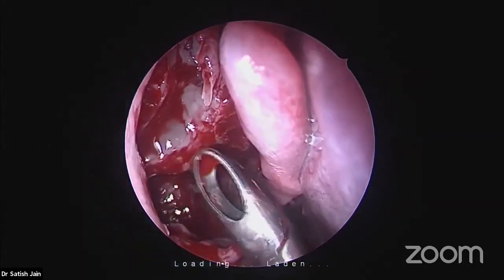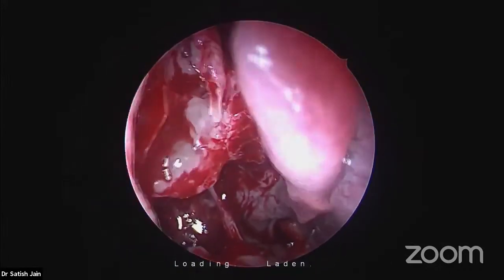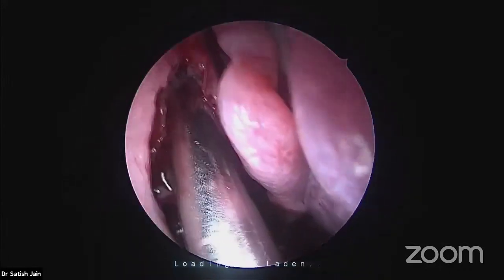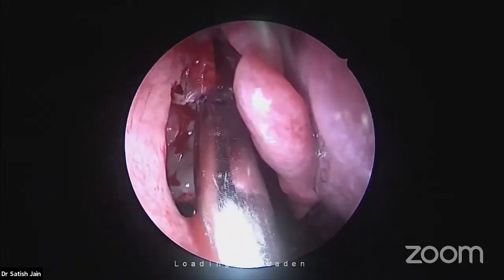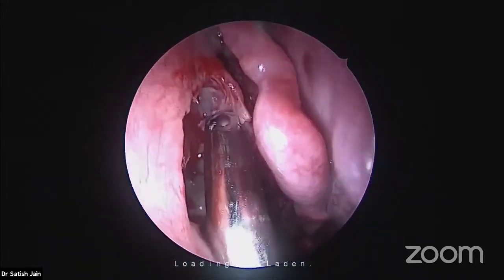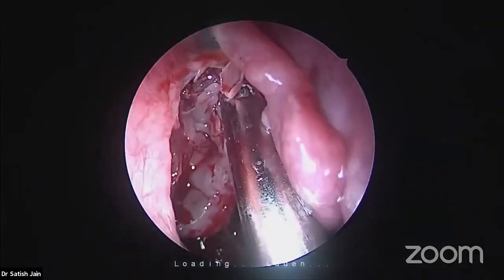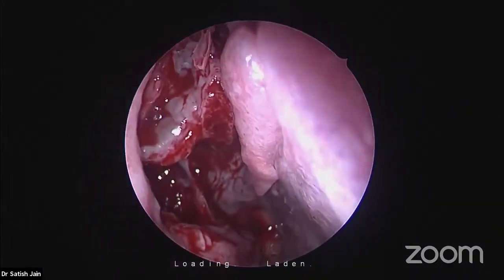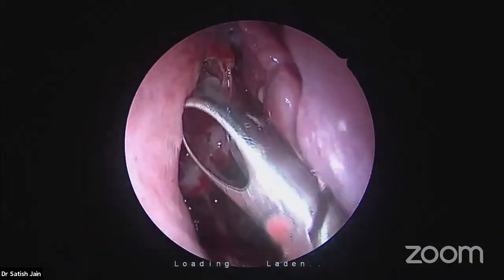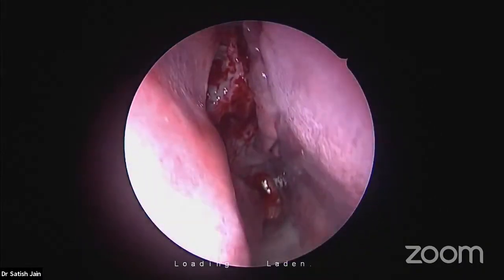Sir, I had one more question regarding Denker's. In these angiofibroma cases, I also do modified Denker's for all these approaches, but I have had two patients with nasal valve collapse, because I removed the upper piriform. See, alar collapse is a very big problem, so it is important to sort it out. I always mention this when doing Denker's.